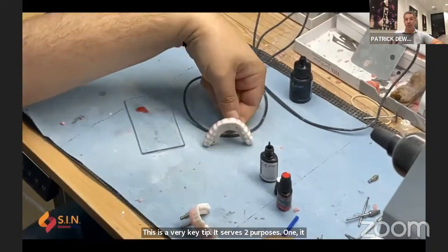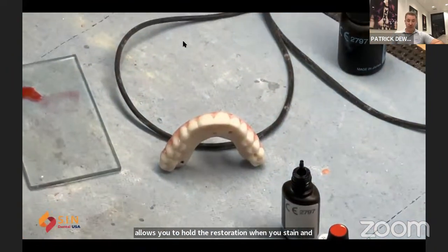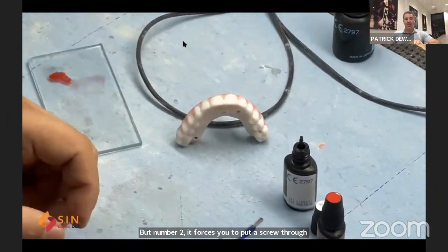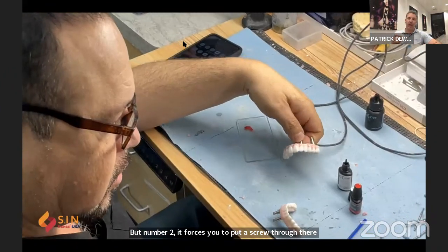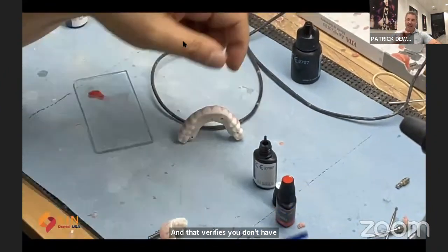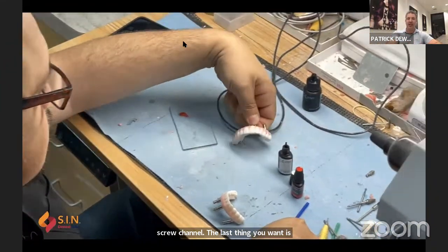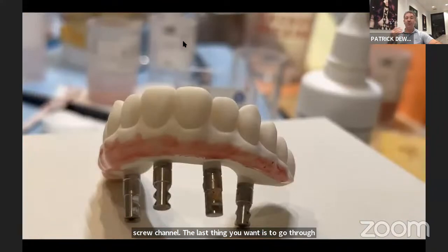But number two, it forces you to put a screw through there. So we'll put the PRH30 screw to screw onto analogs, and that verifies you don't have any extra resin in that screw channel. The last thing you want is to go through the process of staining and glazing and then realizing that there's resin that's cured inside the screw channel and you can't get the screw in the restoration.